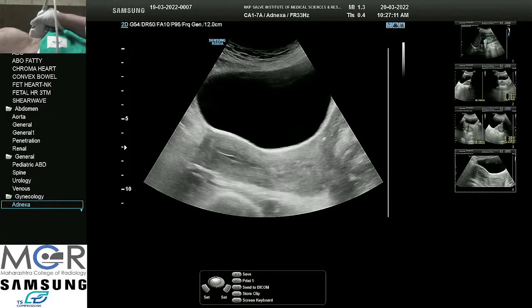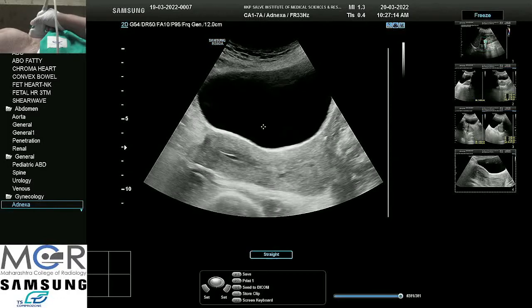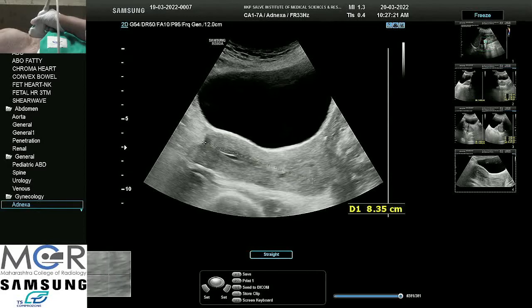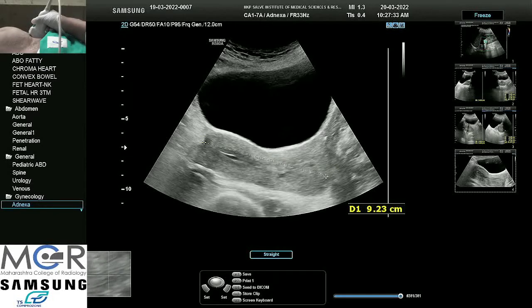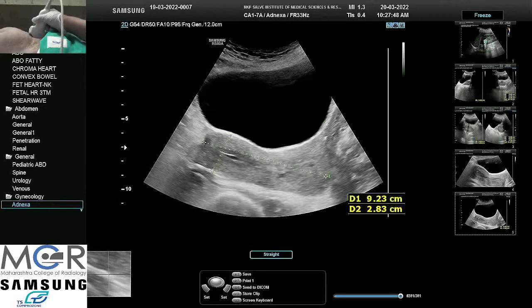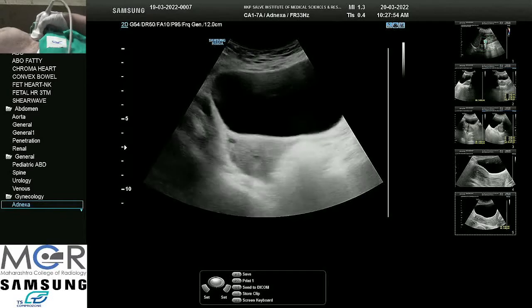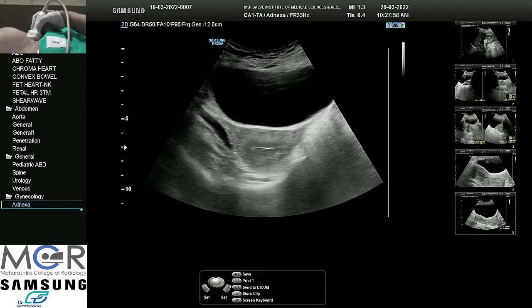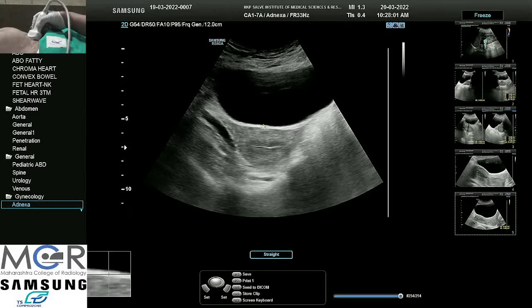Now we will take the measurement of the uterus. The measurements are taken from the fundus to the cervix — the full length. This lady is a multiparous woman, 38 years old, so this length of the uterus seems fine. When we want to take the AP diameter, we take it at right angles to this measurement. In transverse section, we turn the probe 90 degrees from what we have done till now, and at the level of the cornua we are going to measure the transverse diameter.